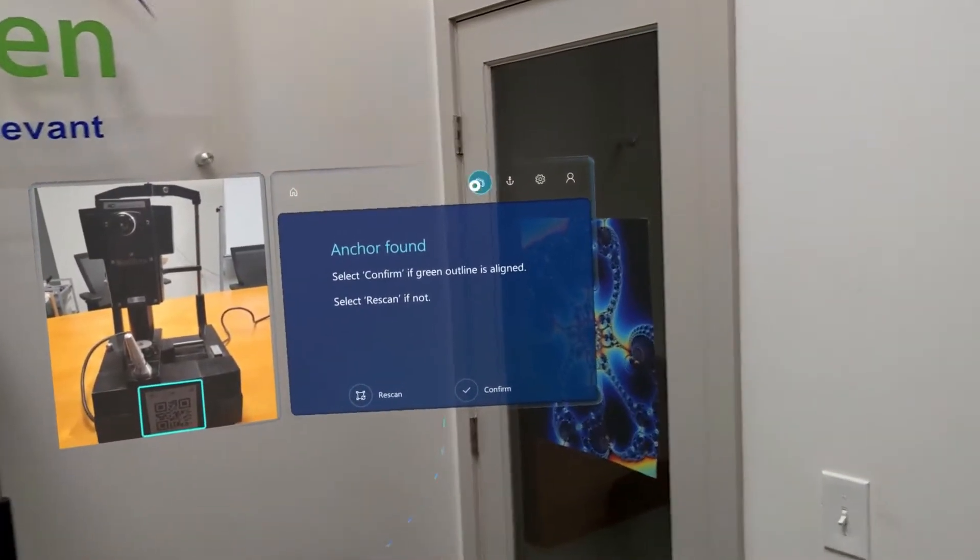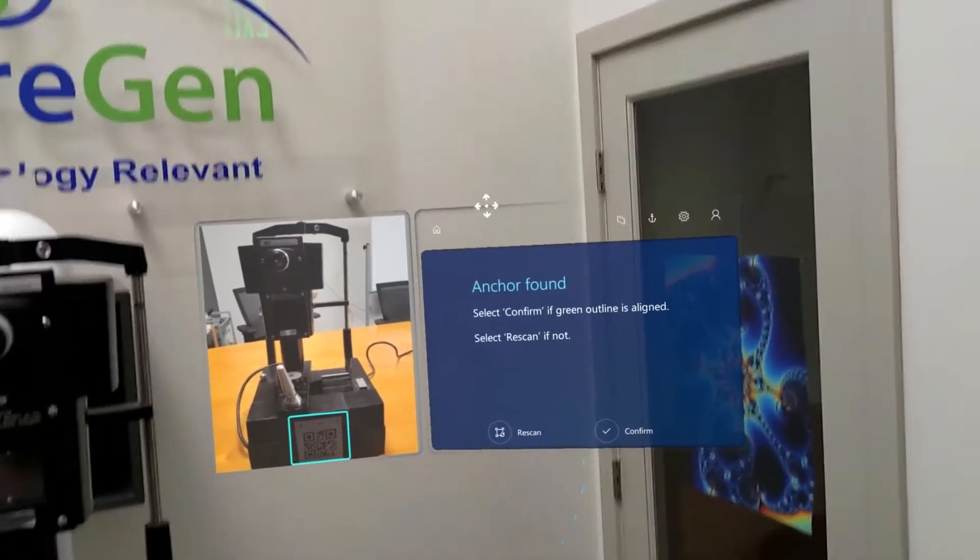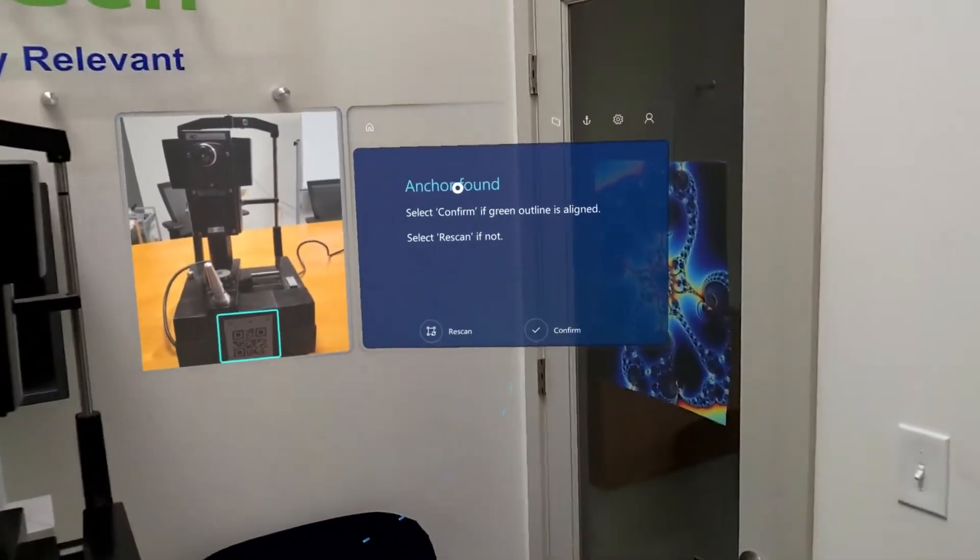I have the option to pin this screen, which I am going to do. At this point the screen will not move from this space until I unpin it.